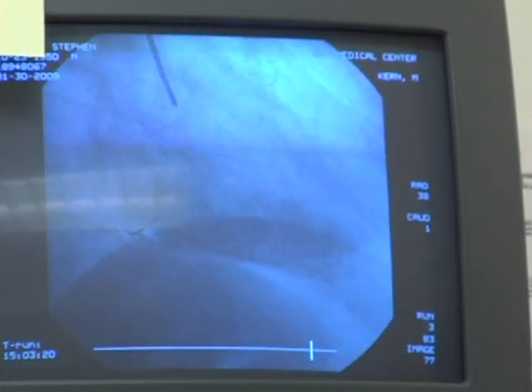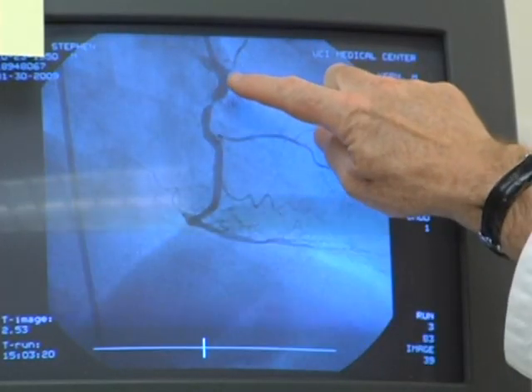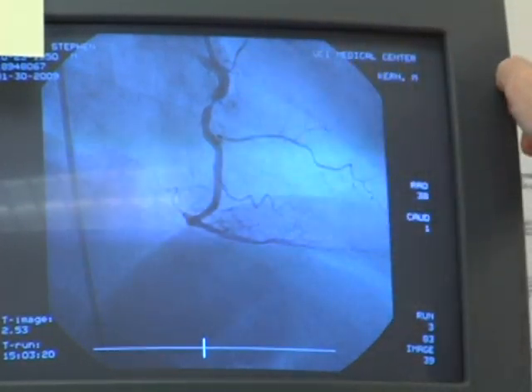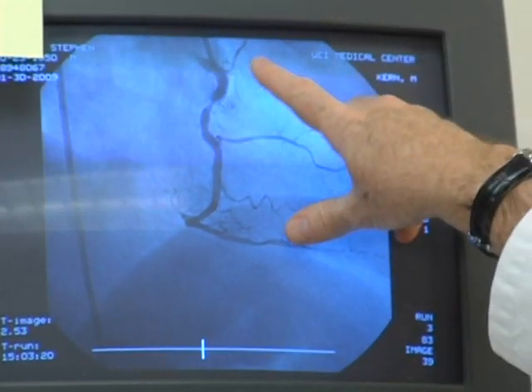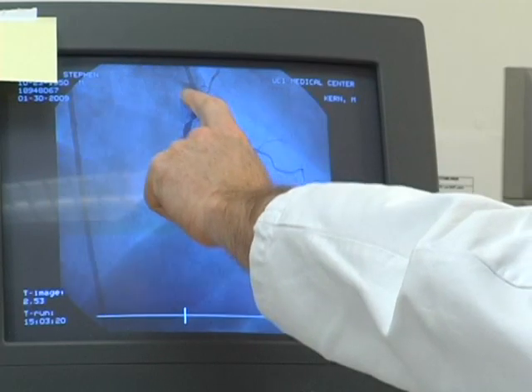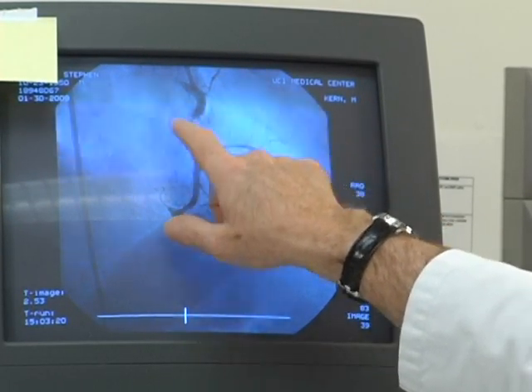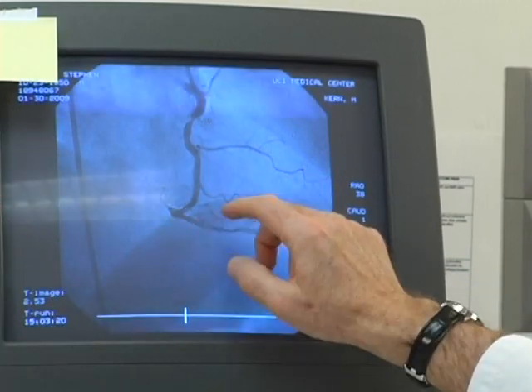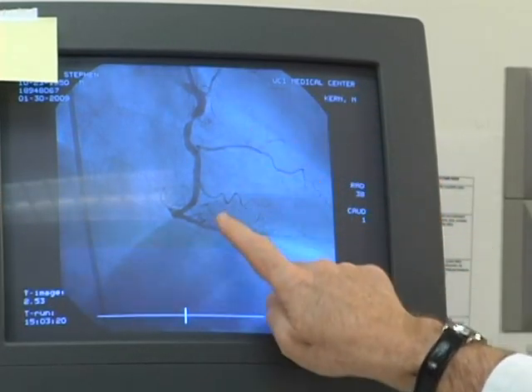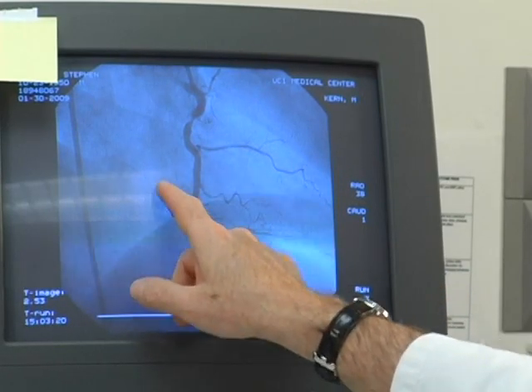and you can see the different vessels again. So let's just look at them. So the first branch coming up and going anterior toward the pulmonary artery is the conus branch. The SA nodal branch would be a branch that goes posterior. Here's our stenosis in its second view, and it's tight in this view, and it's also tight in the other view. RV marginal branch, posterior descending, AV nodal branch up this way.